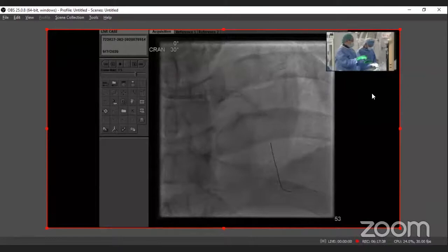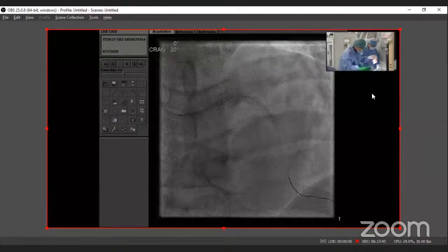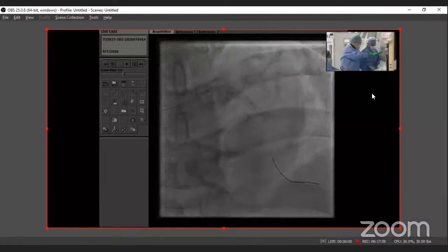the circumflex. Now, either you use a new wire, the other wire, to wire it, or using this to wire. I think both are okay. If you use a jailed wire, it's probably pretty sure that it's within the stent struts again. But I think we're not going to use this wire. In this case, it's already spoiled, so difficult to wire. Can we use the one we ran through just now?